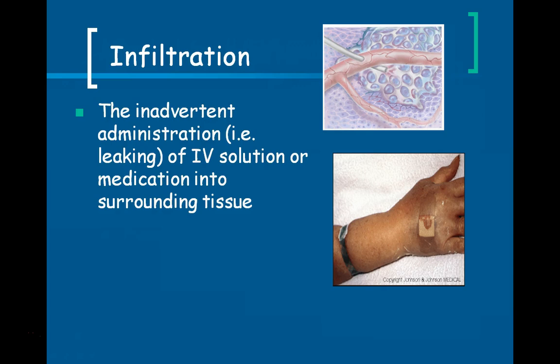The needle may go all the way through the vein when the IV is being started, and that's the picture on the top here in this slide shows the cannula going all the way through the vein. Usually, if the cannula went all the way through the vein, we see that at the time the IV is being started. We see hematoma forming really quickly, and we pull the IV out.